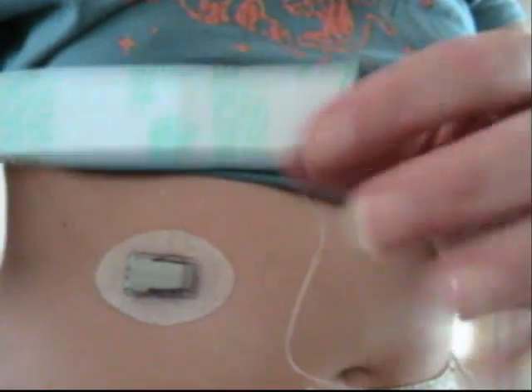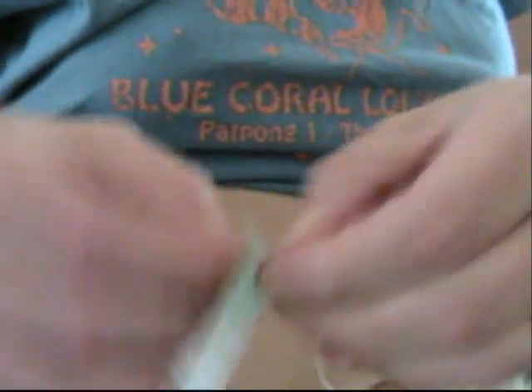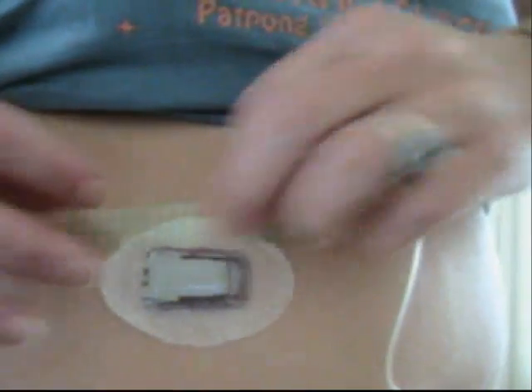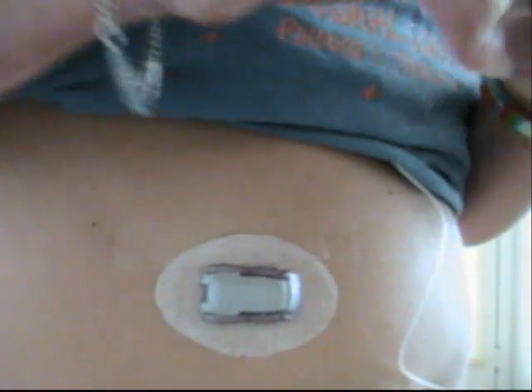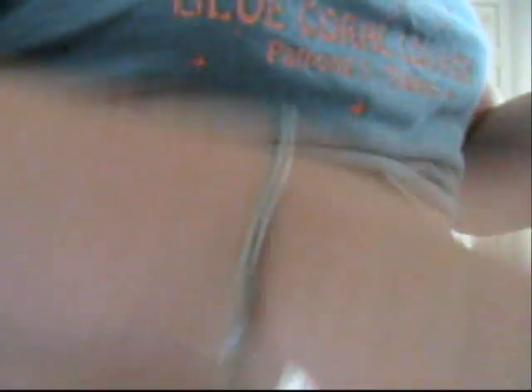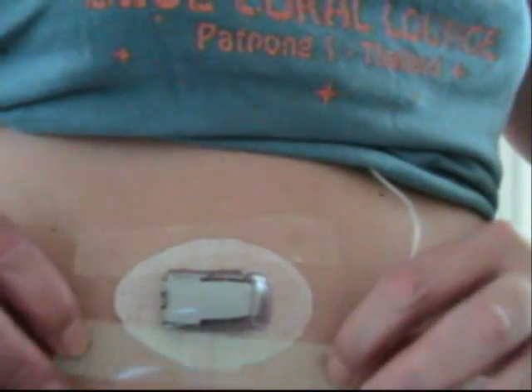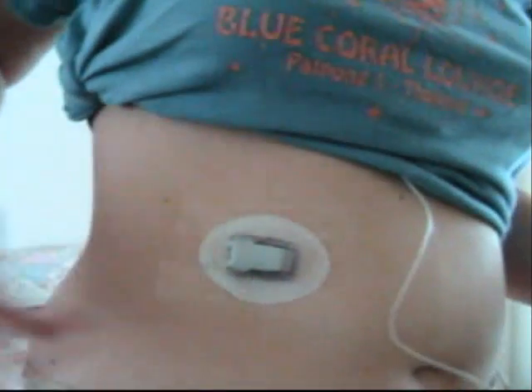Here is the FlexFix that I've already cut. You start by taking the white backing off — this side right here is sticky. You just set it down and rub it good, and then these little tabs come off; they're just to help you hold on to it. So let's tape that down, and let's do the next one. We've got the strip sticky side down, and there we go. You could honestly stop at this point — this will hold it on well enough.